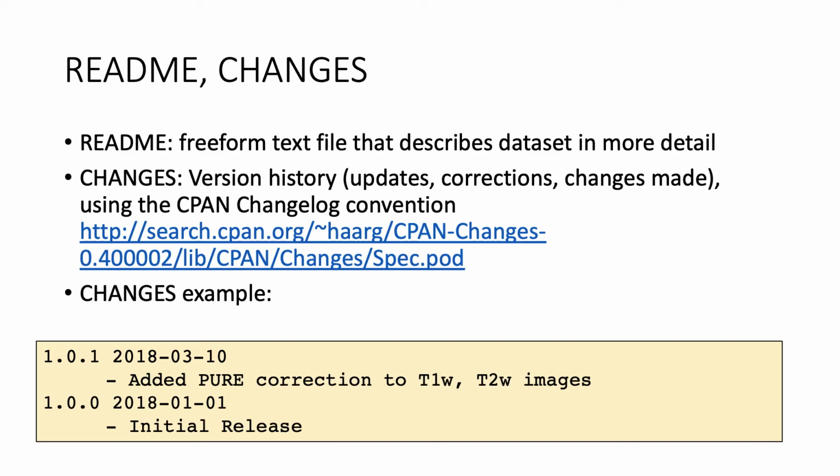Maybe early on you are running your paradigm and find that you thought it was writing out an event and it really wasn't writing it out to the file. So you made that correction, you might need to document that here, that you've made some sort of adjustment to what's in your data file.